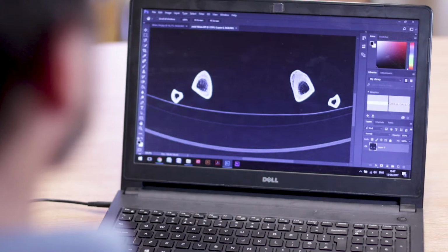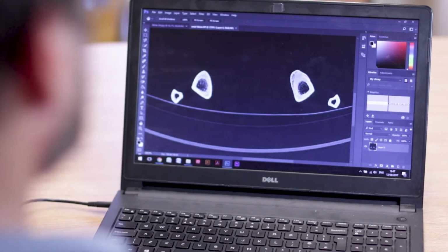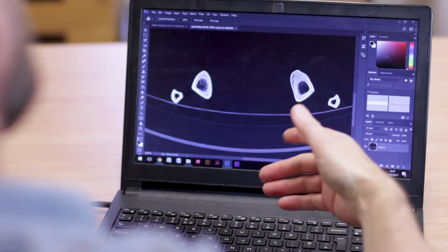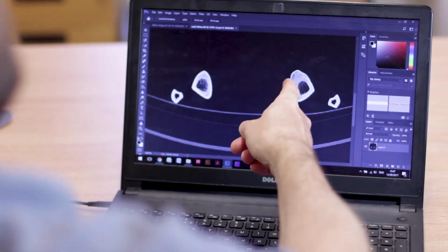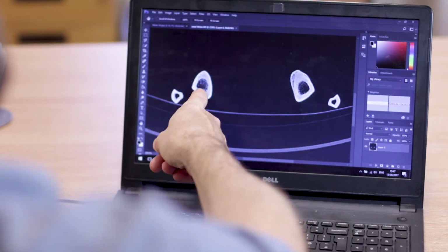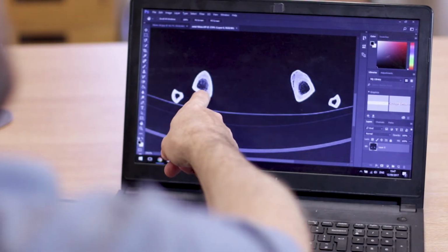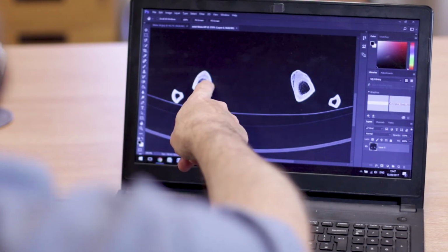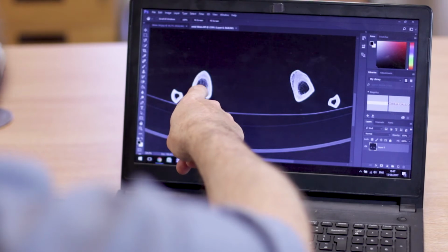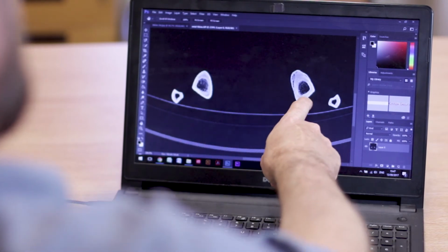This is one of the pictures from the person who was wearing leg irons. It's a cross-sectional picture through the tibias, which are these bones here, and the fibulas, which are the smaller bones in the leg below the knee. This leg is normal here, and this is the thickness of the outer part of the bone and the normal structure inside the bone of the tibia.